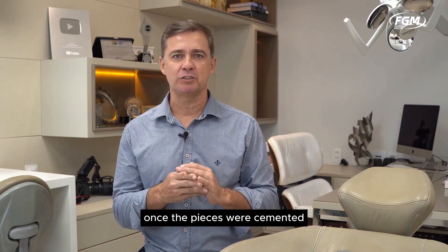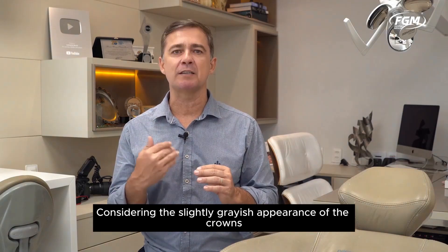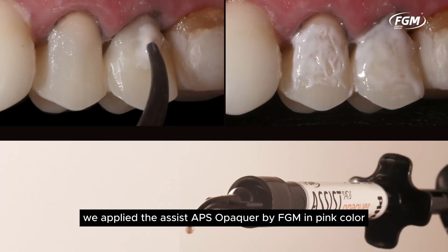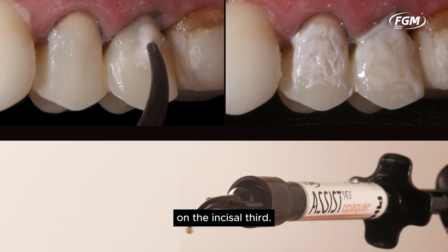Once the pieces were cemented, we proceeded with the restorations of the vestibular faces. Considering the slightly grayish appearance of the crowns, we applied Assist APS Opacar by FGM in pink color irregularly on the vestibular face of the crowns to increase the value of the final restoration. Note that the opacifier was not applied on the incisal third.